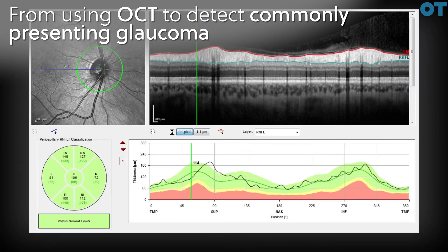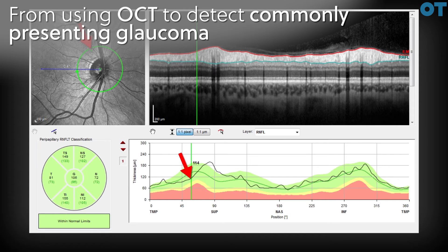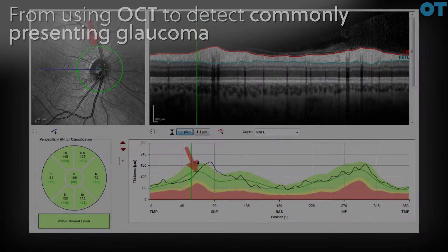The retinal fibre profile of the right eye whilst looks normal initially — so is everything okay or not? Well, we've got a disc here that's showing signs of excavation. When we look at temporal to superior, the profile sags below and is approaching the fifth percentile. This implies that there may be some tissue loss in that location.